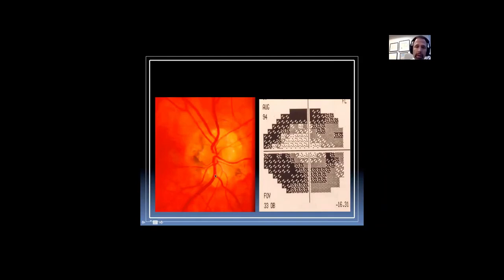And so in this patient with very obvious optic disc drusen both above and below, you get this field defect, which is an almost complete inferior altitudinal defect, with some sparing centrally, and then a less impressive but still superior arcuate field defect because of the compressive effects of the optic disc drusen. So optic disc drusen are accumulations of calcified mucopolysaccharides at the optic disc head.